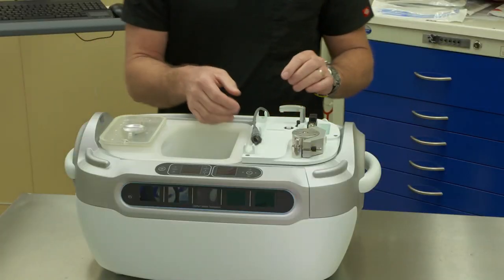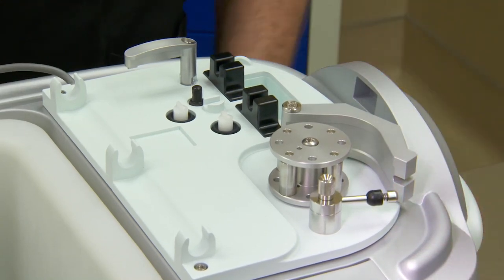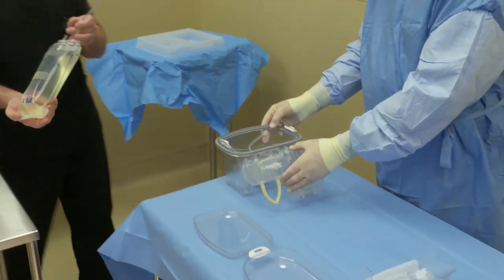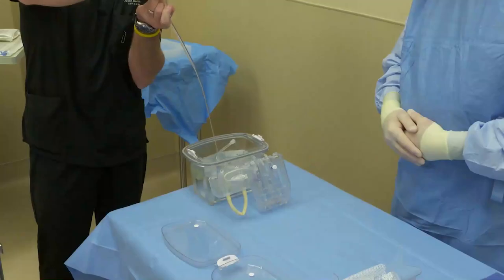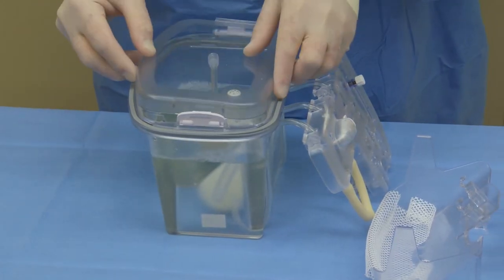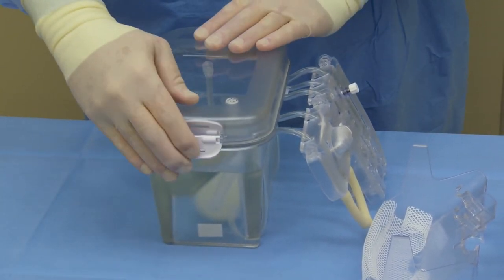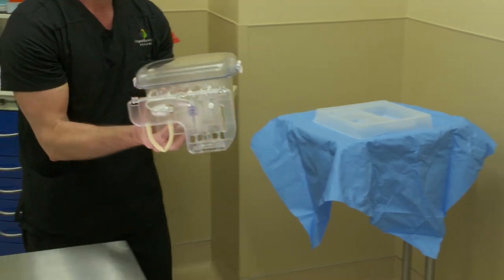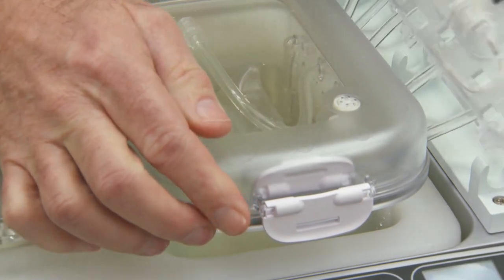A non-sterile person will then prepare the Lifeport Kidney Transporter to receive the perfusion circuit by opening the spring latch arm, tubing raceway, and locking arm. The sterile person on the field will then place the perfusion circuit on the edge of the table in preparation to receive one liter of KPS-1 preservation solution. Inner and outer lids are then replaced on the Lifeport Kidney Transporter perfusion circuit. The circuit is then handed off the sterile field to a non-sterile person for finalization of setup, and the perfusion circuit is placed into the Lifeport Kidney Transporter ice container.